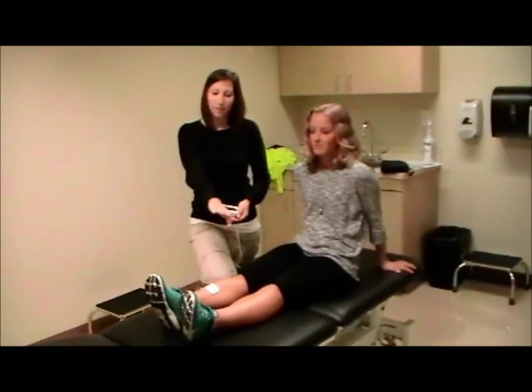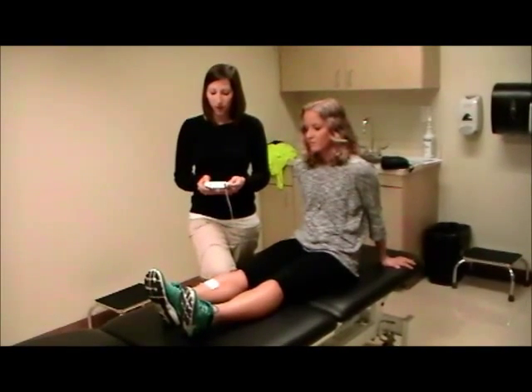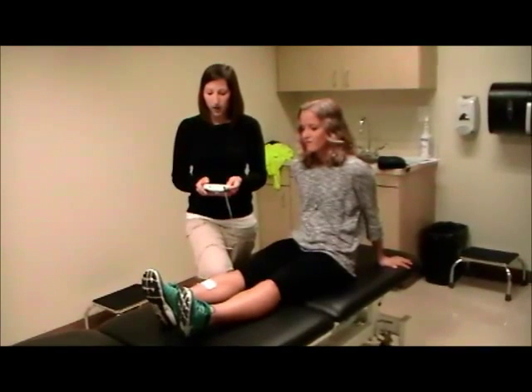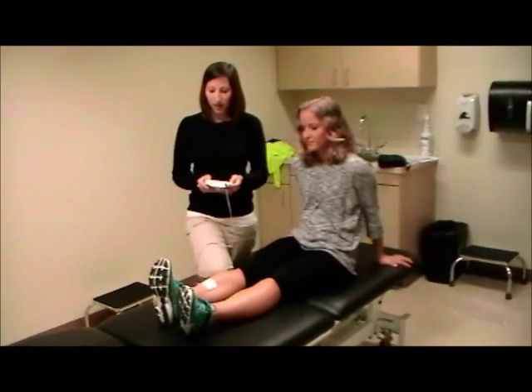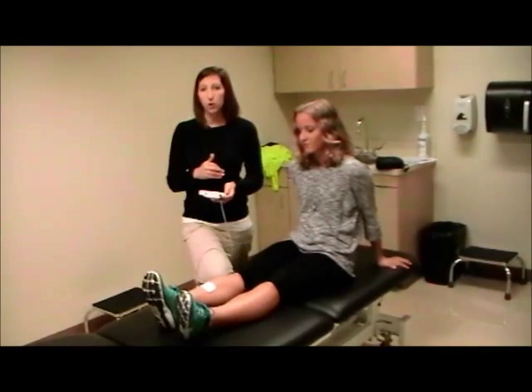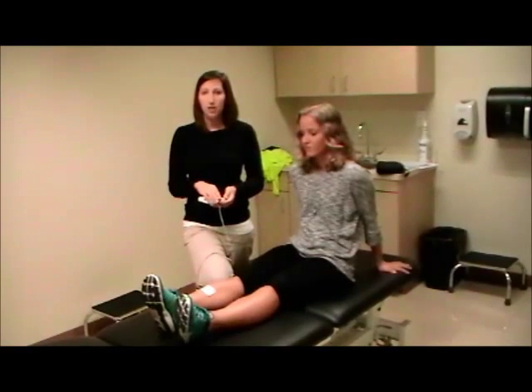All right, so here we go. I'm going to have her relax the other ankle. I already set my parameters. Let me know when you start to feel it. We're going to go up until it takes to dorsiflex the ankle. So I'm going to turn it to 6 seconds on, 20 seconds off — 5, 6, and relax. I'm also going to give her a cue, so I'll tell her when it's going to turn on so that she can facilitate that contraction.